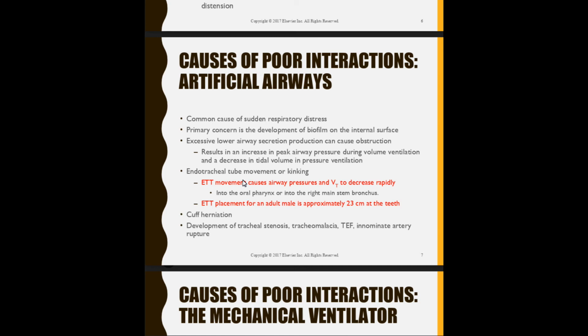I'm ventilating 500 mLs on one lung. That's going to mess them up really badly. Okay, and that's where you're going to have that asynchronous event, because now you're going to have high pressures because one lung may not take 500 mLs. So you're over distending the alveoli.